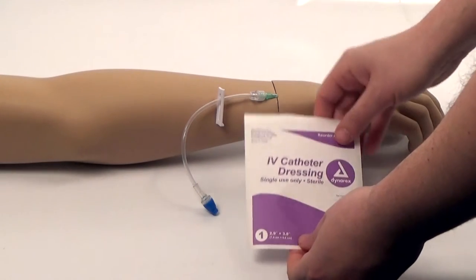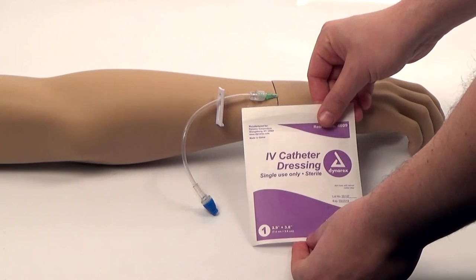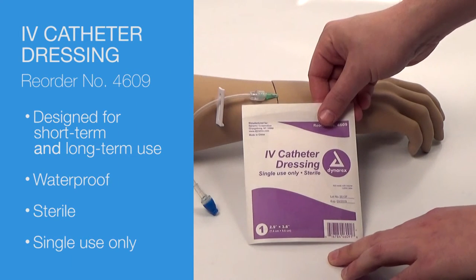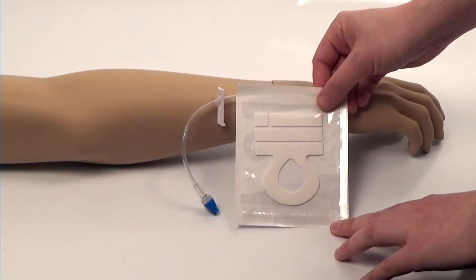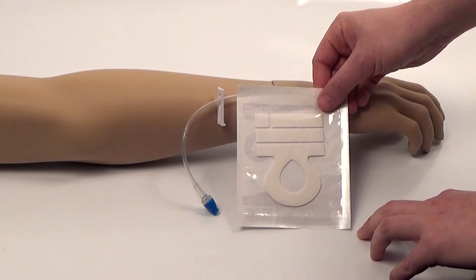The Dynarex IV catheter dressing is designed to secure the IV catheter in place on patients. It's designed for both short-term and long-term use, is waterproof, sterile, and single-use only. It also comes with extra foam strips which providers can use to document or write anything on as they're putting it onto the patient.